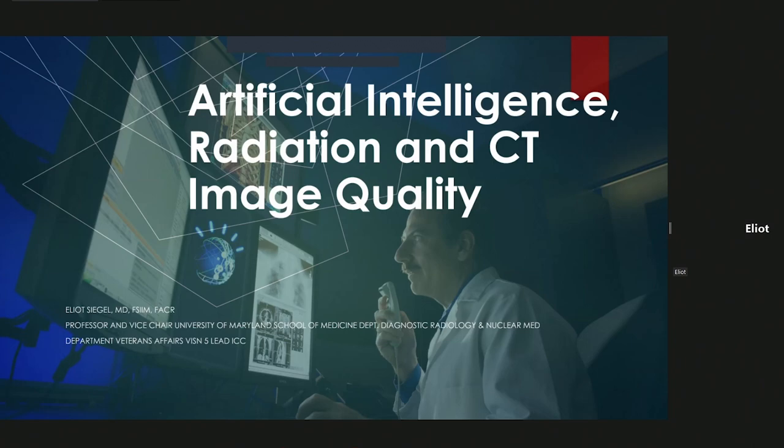I think in general, that correlates fairly well with some of the more sophisticated techniques that have picked particular areas of an image to try and determine noise. But of course, noise varies across an image from one sequence to the other, from one image to the other. But I found it fascinating how relatively well and how relatively simple the assessment of noise was by just essentially creating regions of interest and then looking at standard deviations and maybe even doing power spectra, looking at the noise of the air outside the patient. So thanks for letting me clarify that.